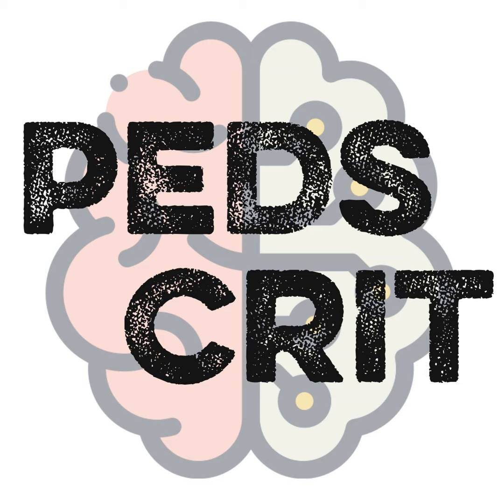So we get an idea of clot formation and then fibrinolysis, or clot breakdown. The tests are not available at every center and they are expensive, so those are some of the disadvantages. But the advantage is you get an idea of function. So not only are you getting an idea of platelet quantity, but actually quality. How well are your platelets actually working?